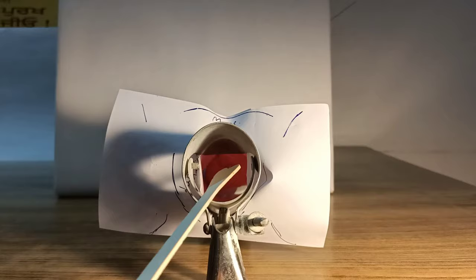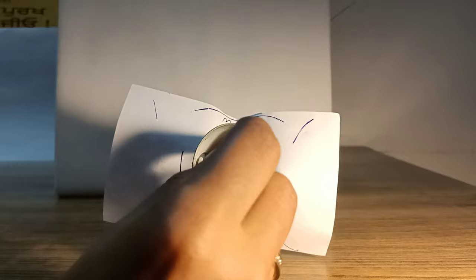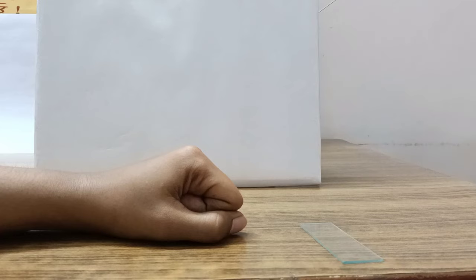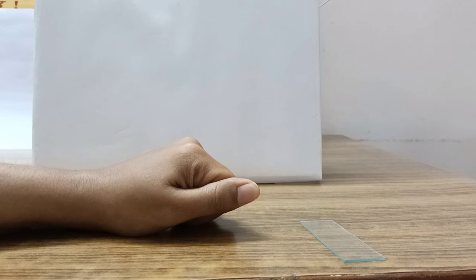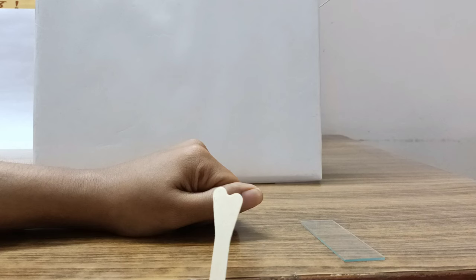To make it more clear I'm going to explain it on my hand. Imagine my hand is a cervix and you can see a slit-shaped external os. I'm introducing the Ayre spatula through the vagina till the cervix. It has a long end and a short end - the long end is going to go into the endocervical area.